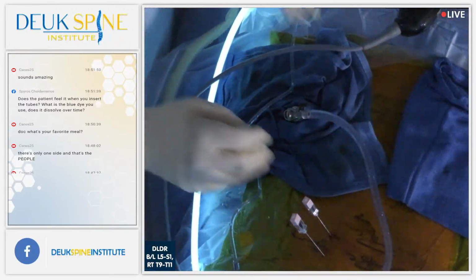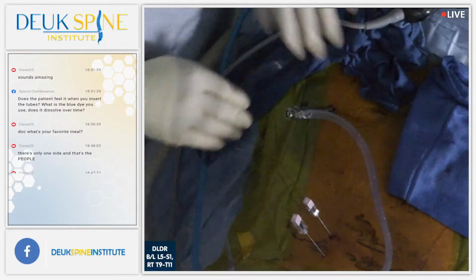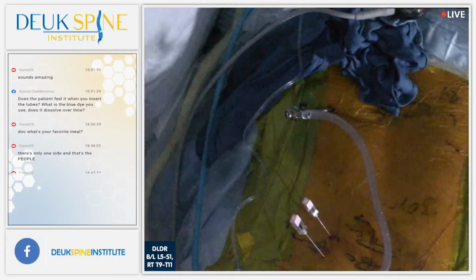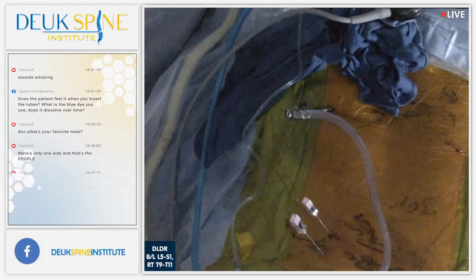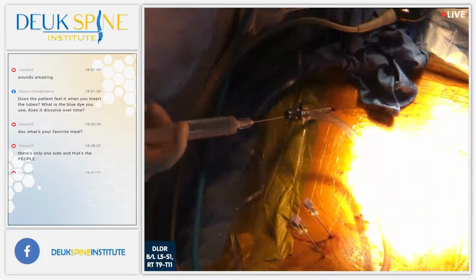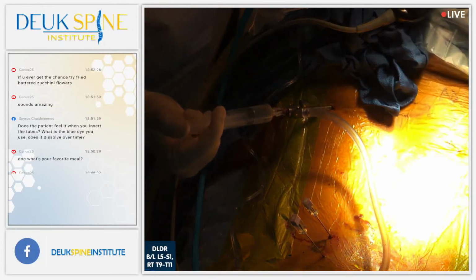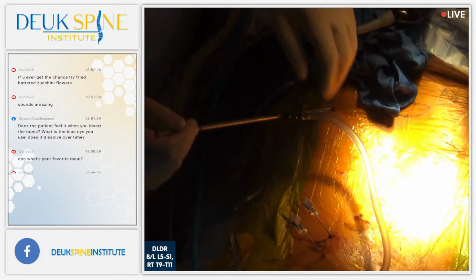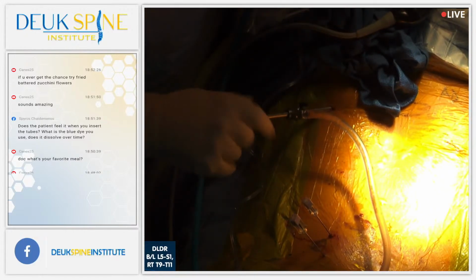Just about done. 2 more to go, thoracic. But thank you for bringing that up, I think. It's motivating me. But no, that disc went very well. We did both sides, and he needed it on both sides. You saw he had a lot of inflammation on the right, more even on the right than the left.